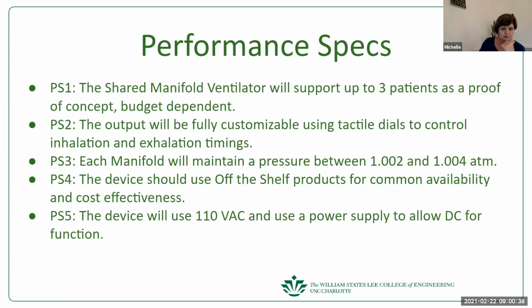Also on PS3, are we confident that our pressure sensor can measure to that accuracy? And then what does our loop look like to increase the pressure if it's too low, or vice versa if it's too high? First of all, yes, definitely the pressure sensor.